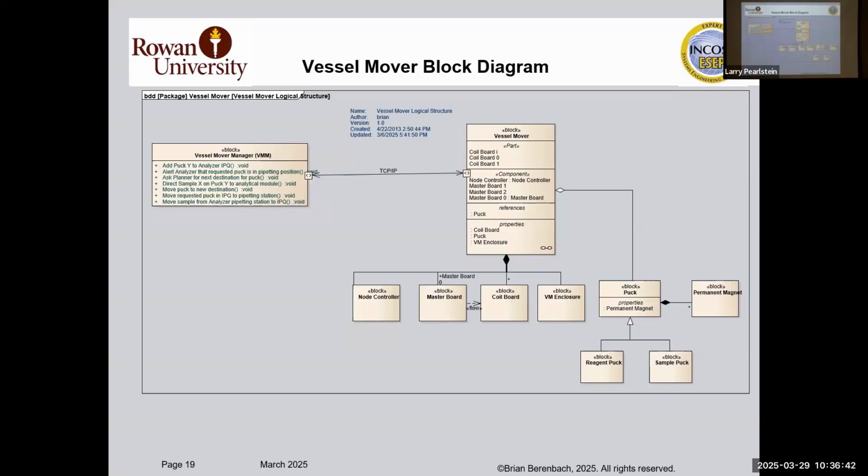Well, what you do here is you load it like a sample, put it in, and the vessel mover moves it around, takes out the old one, sticks in the new one, and it's good to go. So nobody has to touch it once you've loaded it on the railroad car. That's it. It's amazing, isn't it? Yeah. I always screw up when I open up my printer. I'll show you a picture of them doing that.